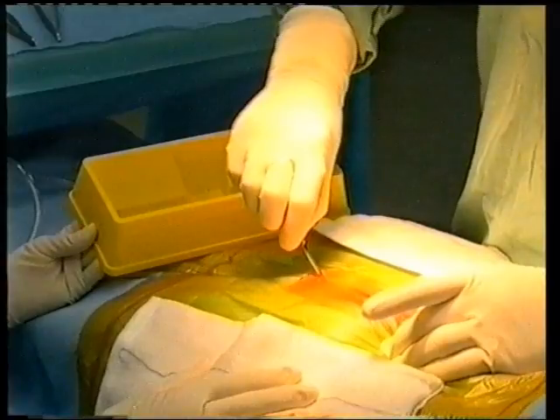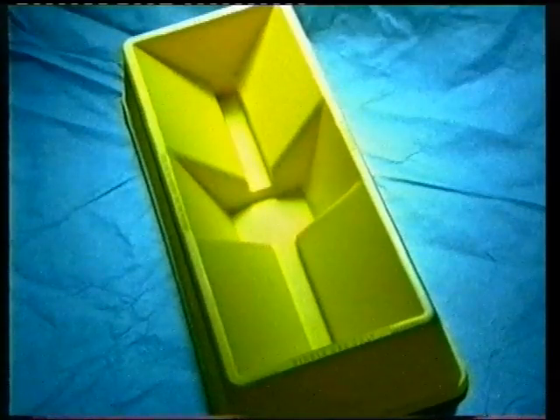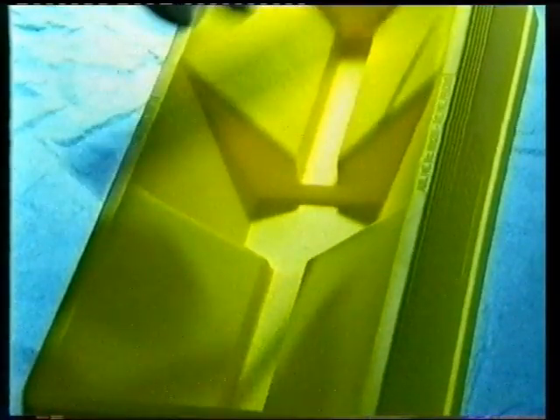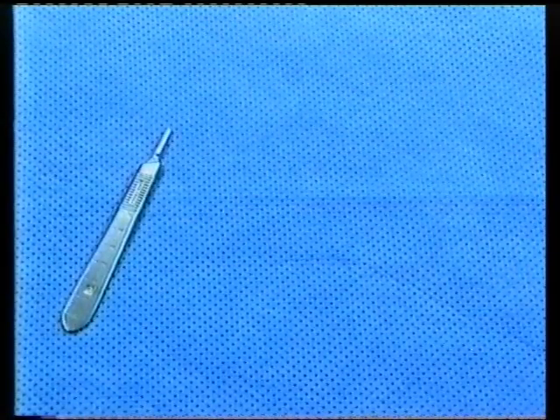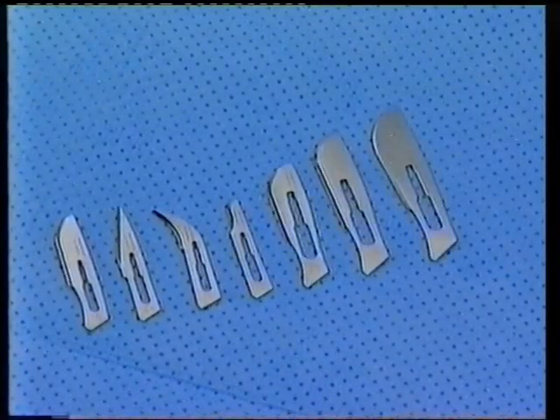Surgeons will find removing scalpels from the ScrubSafe device easy and safe. They don't have to take their eyes off the surgical site to do so. They simply reach in and their fingers are automatically guided around the scalpel handle only. By being able to get their fingers to the underside of the handle, they can get a good grip to safely remove the scalpel. To replace it, they only drop it into the ScrubSafe at a slight angle, causing the scalpel to spin on its descent and sit flat in the bottom recess. The ScrubSafe device accepts handle sizes 3, 4, 7, and 9, loaded with scalpel blades size 10, 11, 12, 15, 20, 21, 22, and 23.